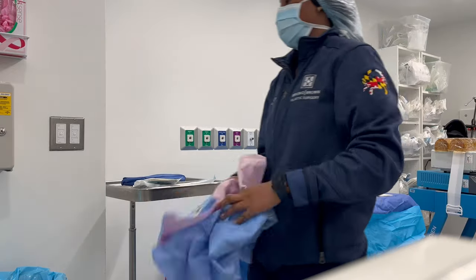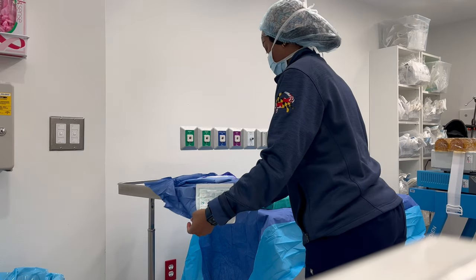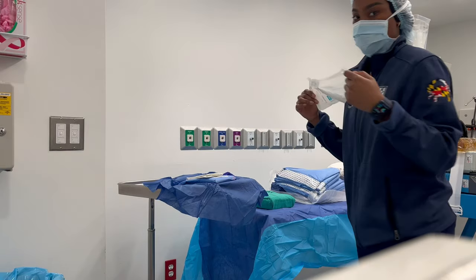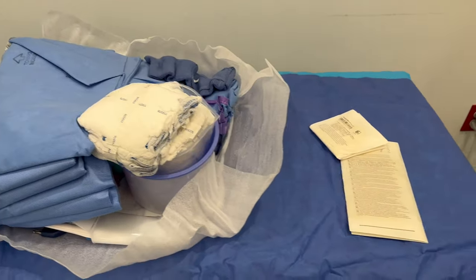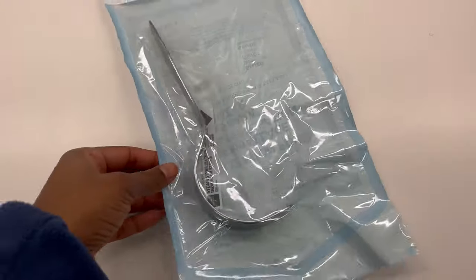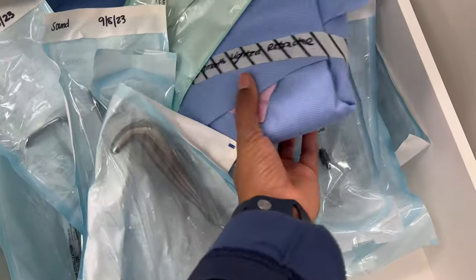There's just specific things that I won't open. I don't even open sutures beforehand because I don't want to open extra sutures that cannot be re-sterilized. You can't re-sterilize sutures, right? And you're just wasting that. So that's what my table looks like. Very basic. I did open a few more things after I realized we were going to do implants, because I thought it was just a breast augmentation, but they are putting in implants, so I grabbed a Deaver, and the surgeon said he wanted the lighted retractor, so I grabbed that as well.